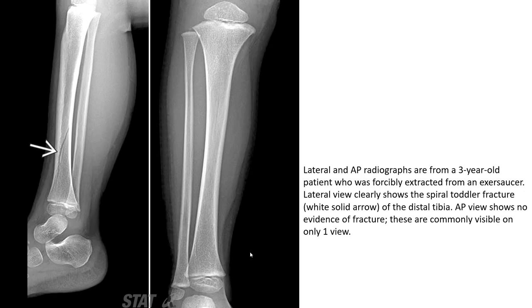Another example on the lateral radiograph in the same patient shows the mild displacement and overall extent of the spiral fracture of the distal tibia. A third example shows lateral and AP radiographs from a 3-year-old patient forcibly extracted from an exersaucer. The lateral view clearly shows the spiral toddler fracture, as the solid arrow indicates, of the distal tibia.